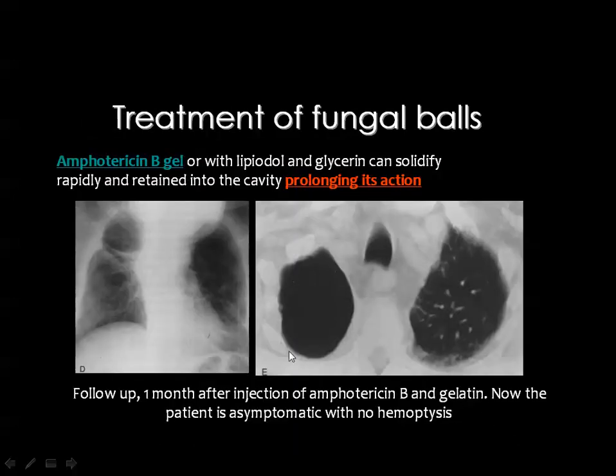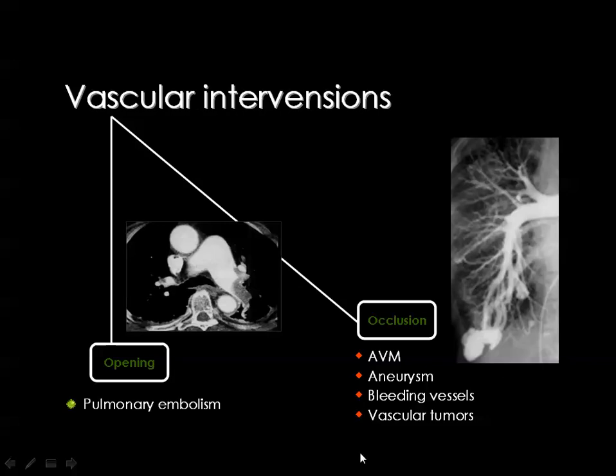Here you can see the cavity, which is free of fungus after death of the fungus upon multiple injections of amphotericin B. This drug may be mixed with gel or lipiodol in order to prolong its effect inside the cavity on the fungus itself.